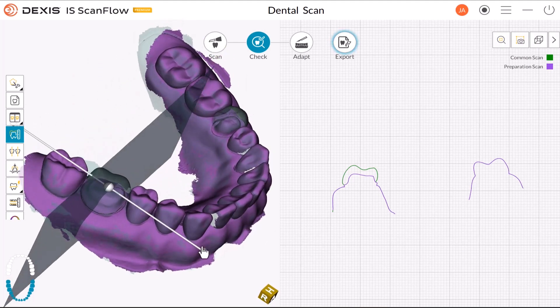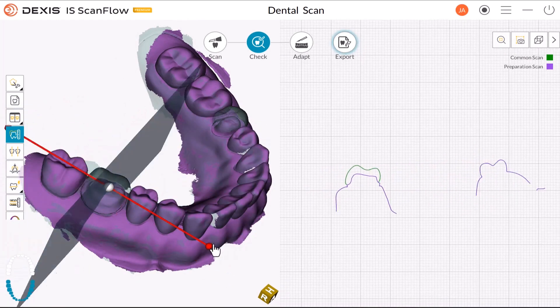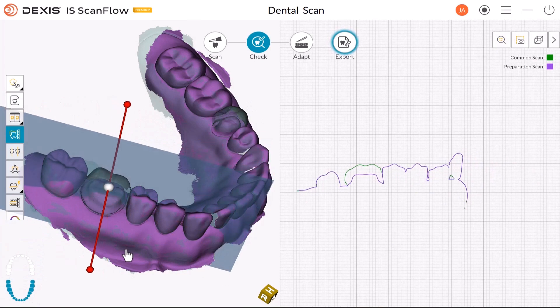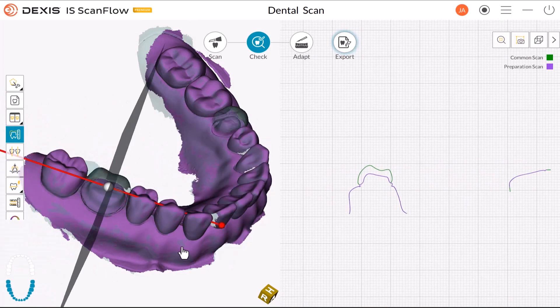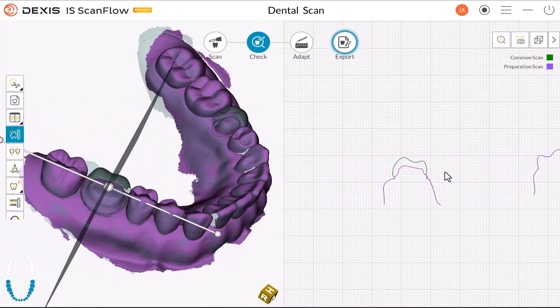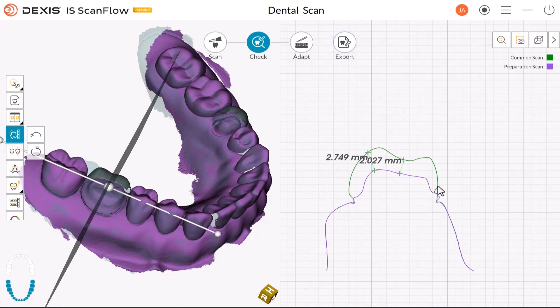Click the buttons at the lower right corner of the grid to change the spacing of the gridlines. Drag the sphere to translate the cutting plane. Click on the top of a tooth and drag the arrow to rotate the cutting plane. Click here to select the measurement tool and select 2 points on the rendering in the right panel to view the measurement. You can repeat this process for 3 measurements at one time.